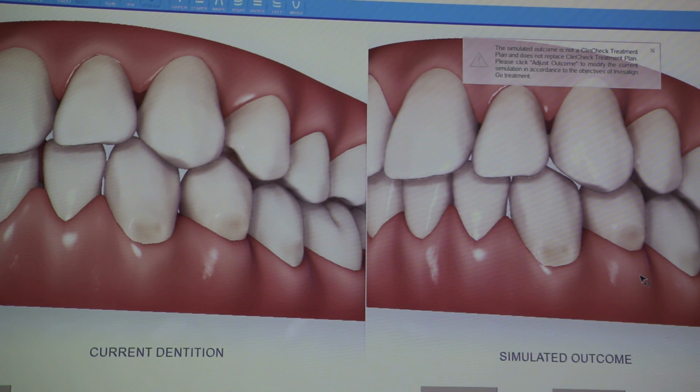Well, we can use clear aligner therapy and put your teeth in better position so that they don't continue to get damaged with abfraction lesions. And there's a product we use called Invisalign, and they're like, let's do it. That's just kind of how it works.